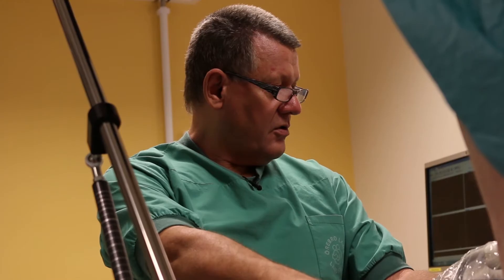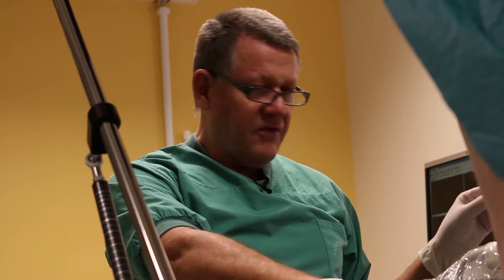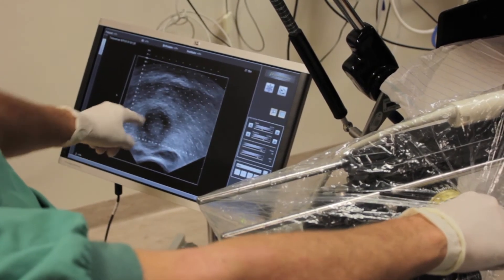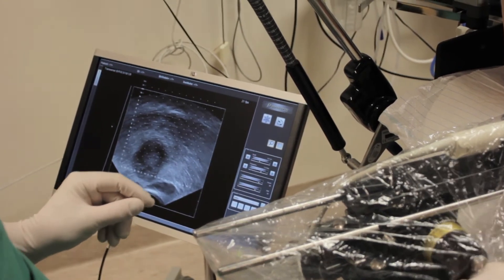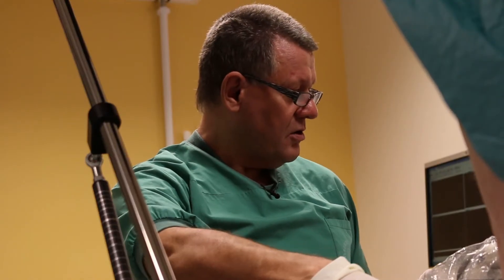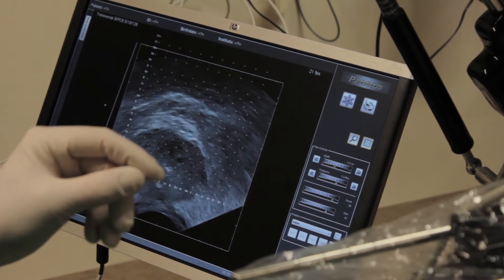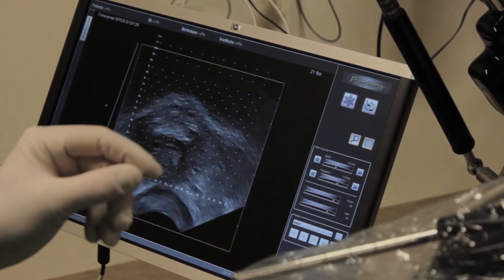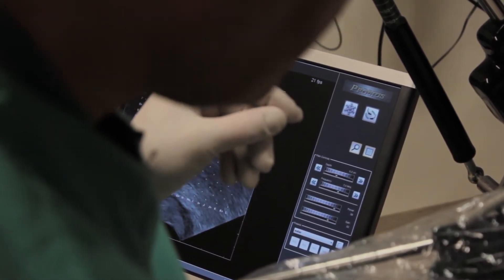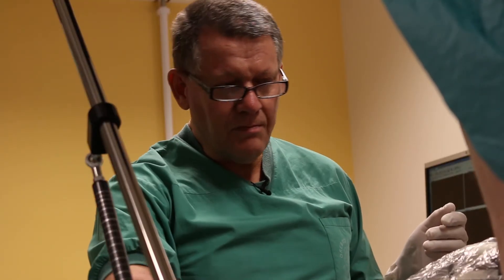The first thing I do is try to identify the base plane. It's a rather good image here where we can see the base plane — that's my zero position — and then we see the prostate gland. I measure the length down to the apex, and the apex is located exactly 38 millimeters from the base plane.